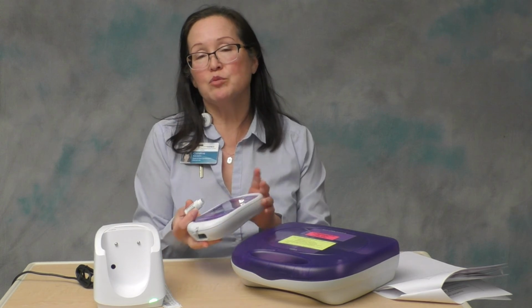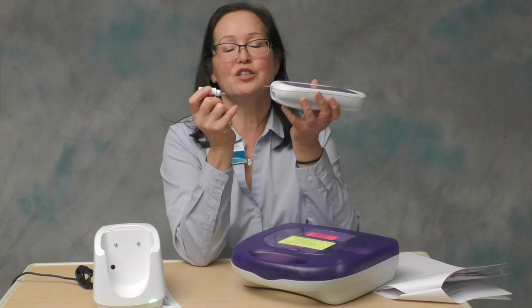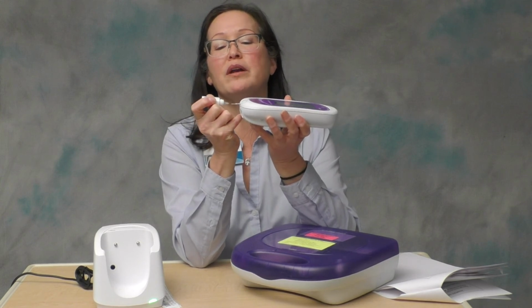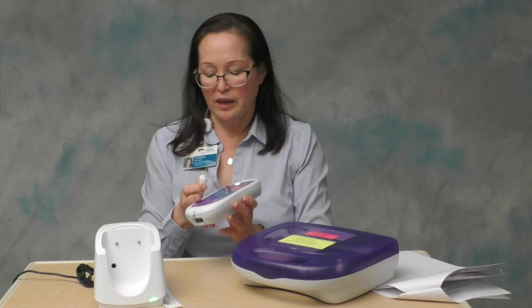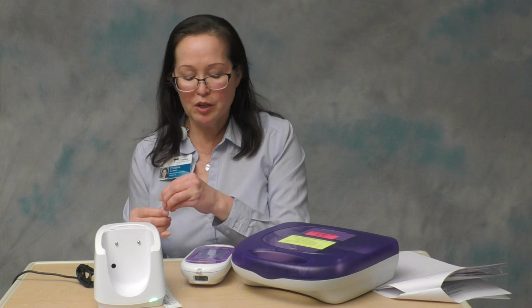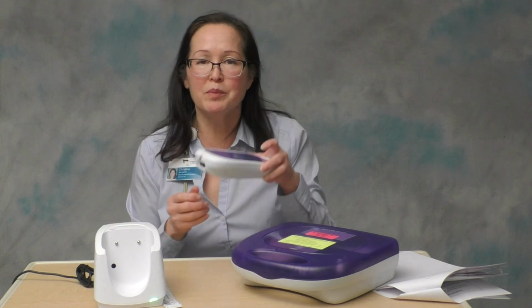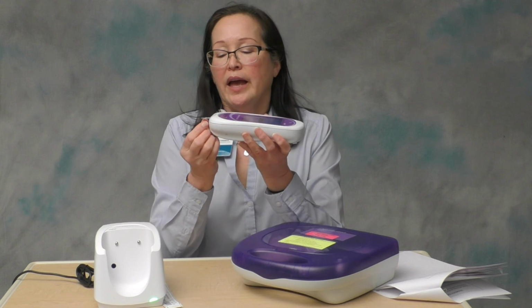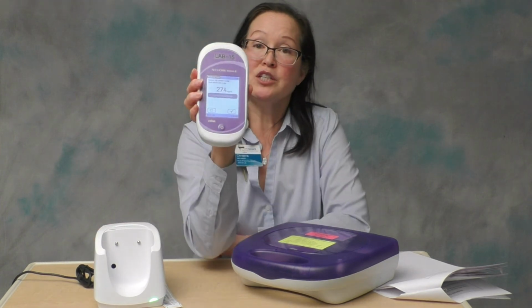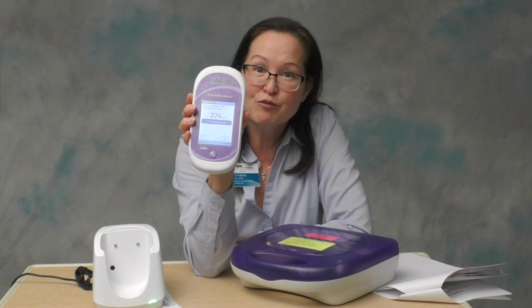I have a fake patient sample here. This is what you'll get during your direct observation to dose with. So again, I'm just going to make sure that I've got a little drop right on the end of the bottle and touch it to the strip and wait for my result. Notice that I am keeping that meter horizontal because there's a strip in there right now. And then I'm going to take this out before I tip it up. So look at that, my patient's glucose is 274, and it's flashing at me telling me that this is out of the normal range.